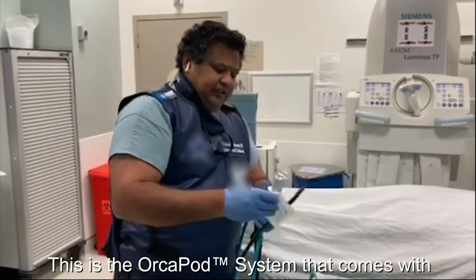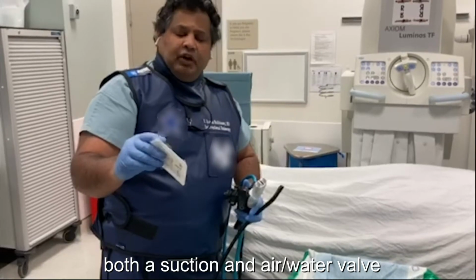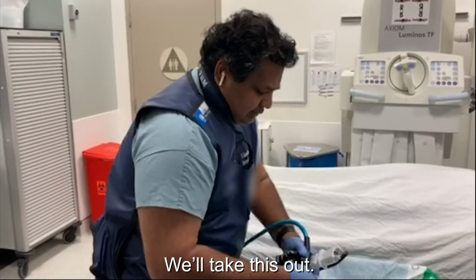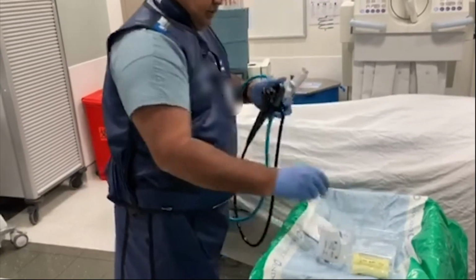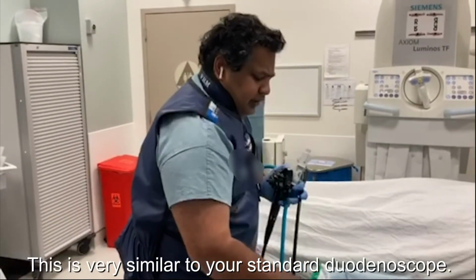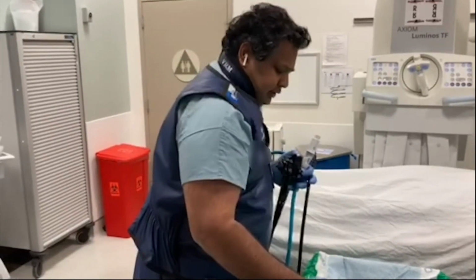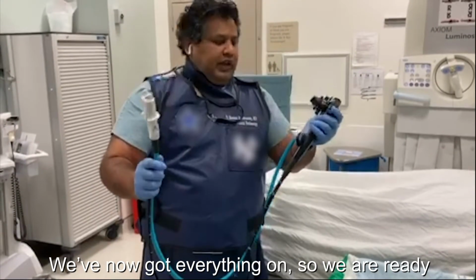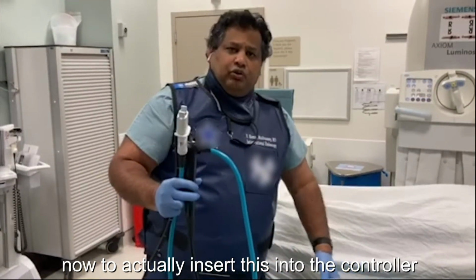and this is the OrcaPod system that comes in essentially with both a suction and air-water valve as well as a biopsy cap. Okay, and so we'll take this out. Got a blue button, air water on the bottom, rinse it first. Okay, so you just put that in. This is very similar to your standard duodenoscope. Again, the red on here, and we have a biopsy cap that we can put on as well. So we've now got everything on, and so we're ready now to actually insert this into the controller, which is on our cart.